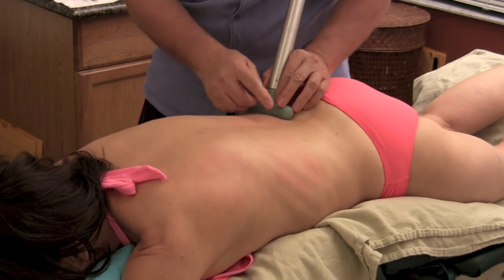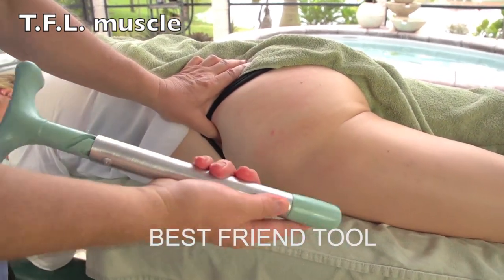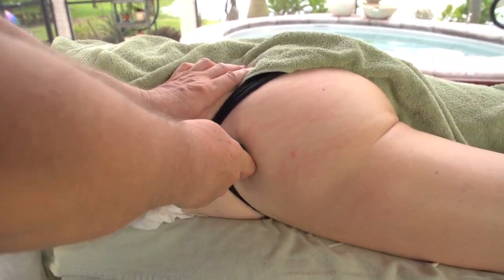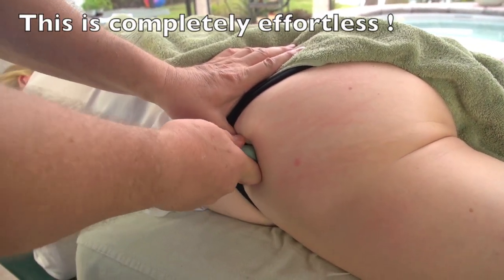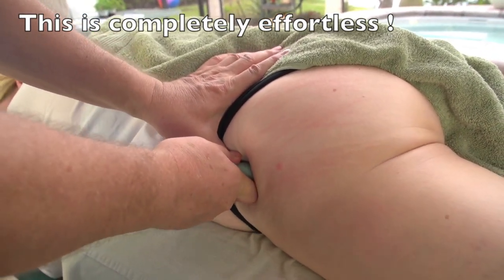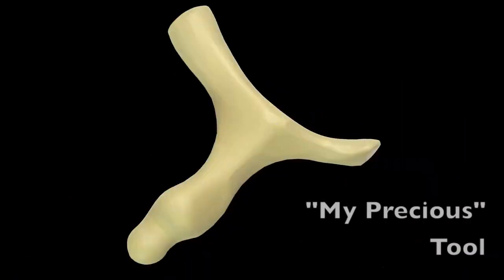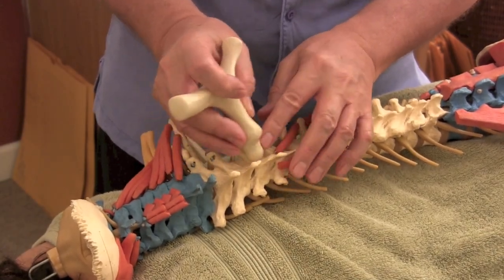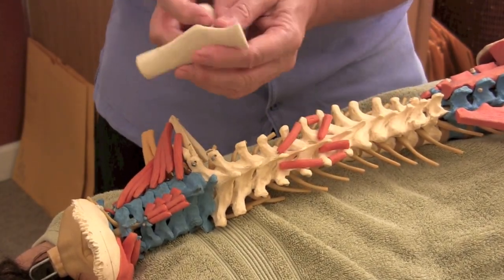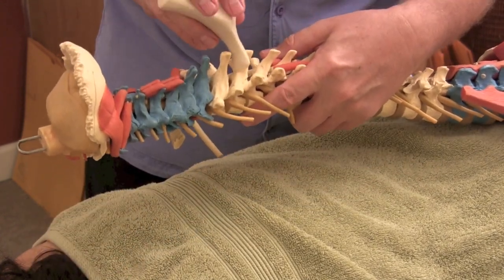You can do that whole area right on the crest of her ilium here. So using the best friend tool with the round tip, I can get in there — I've put the tool against my tummy and have the tool right into that. You can work through there, then take the little tool and work right in between the spinous processes.